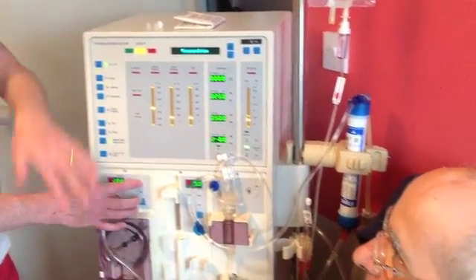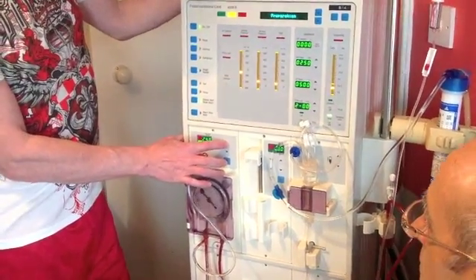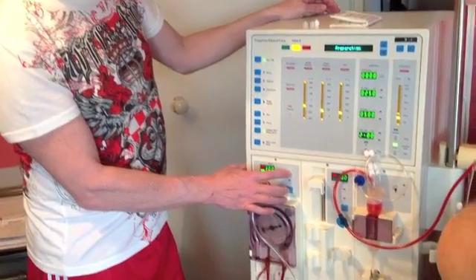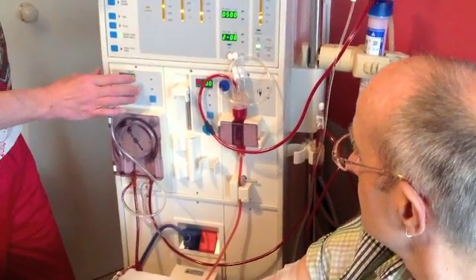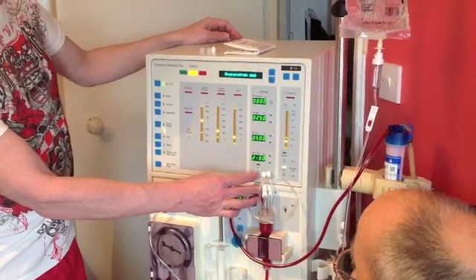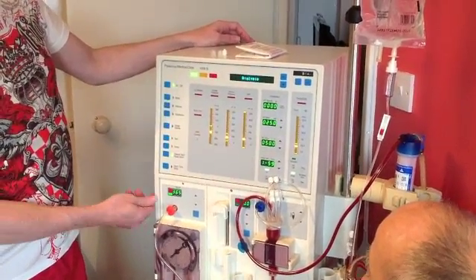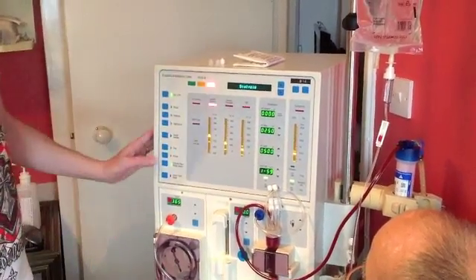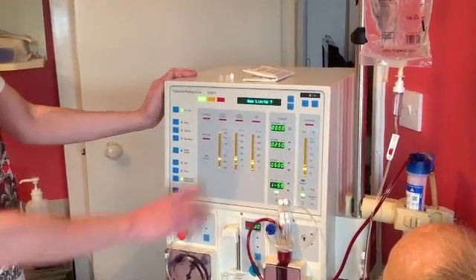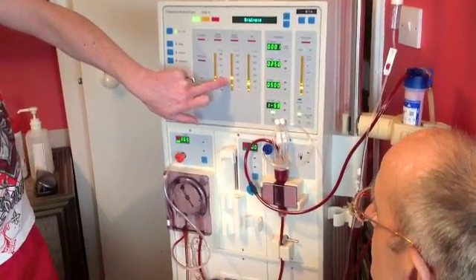Then we gently increase the speed, taking note of these and checking that Alan feels okay. The first main thing you don't want to do is put it on too high a speed so it pulls the blood out of his arm too quickly. We're going to build up to Alan's normal level, which is 365. At 300 at the moment, as you can see the blood's going through and it's now coming through. It will alarm in a moment — press the on/off button there, confirm he's now on the machine for dialysis. Arterial, venous pressure, and TMP will sort themselves out. Press it three times and it will come up with new limits — you will see these barriers.